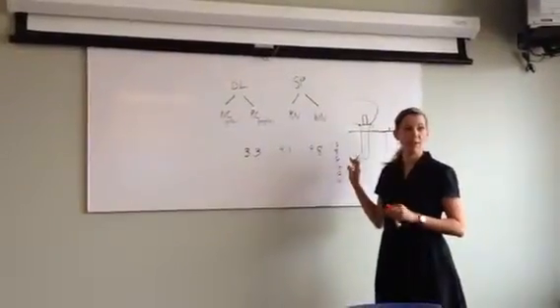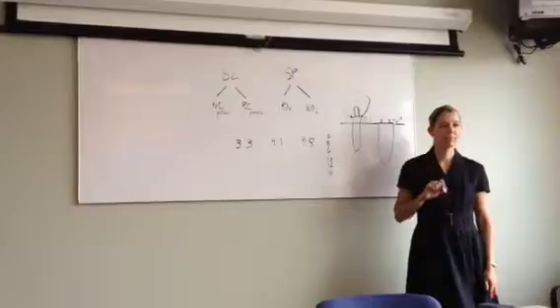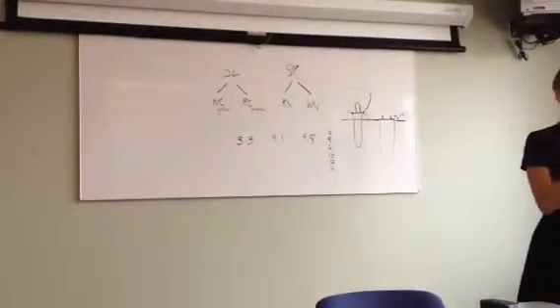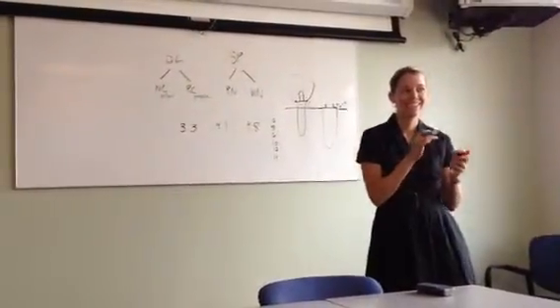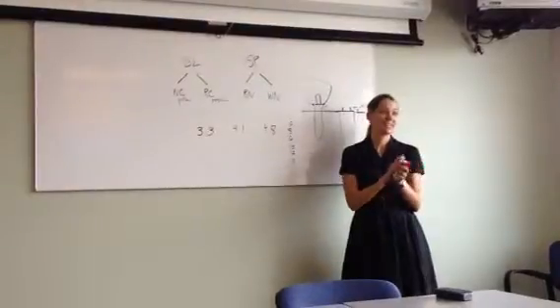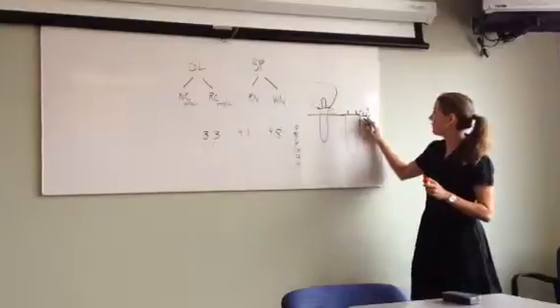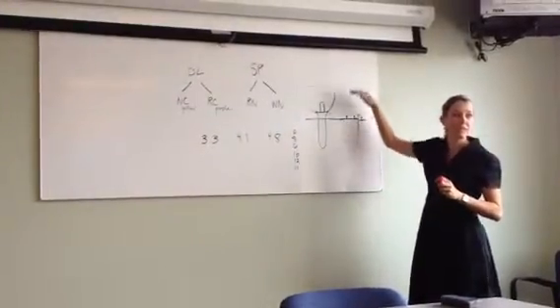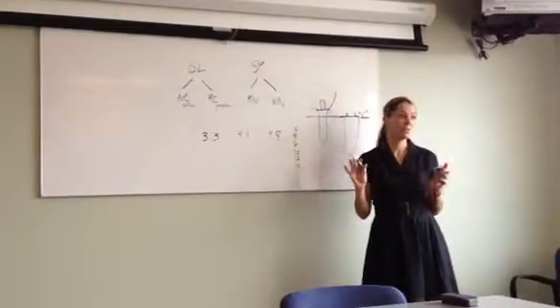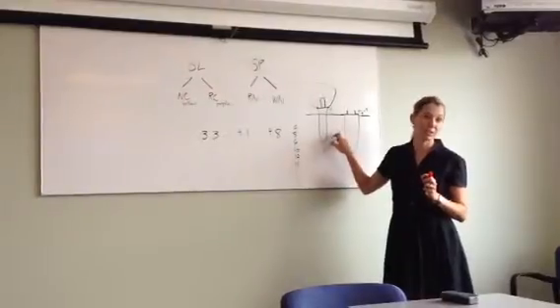What other reason would you use tissue level? Easier impression, because it's above the tissue or at the level of the tissue. It's higher, so it's easier to get to. A lot of people like the tissue level because it's very accessible. With a bone level, if you have a lot of soft tissue, you're working down in a deep dark hole. Today I'm going to show you the impression parts, and they're both very simple. But this is extremely accessible, very easy to get to, especially in the posterior.